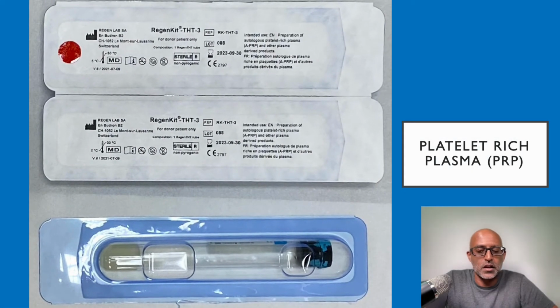As with the HA injections, the PRP has various collection methods available, and these will produce different yields of PRP. Here in the picture is the Regen kit, which is commonly used in Singapore, and there is an additional type which comes with hyaluronic acid already embedded within it. In Singapore, it's approved for tendon pathologies, although there is increasing evidence that it can be used for degenerative diseases as well.